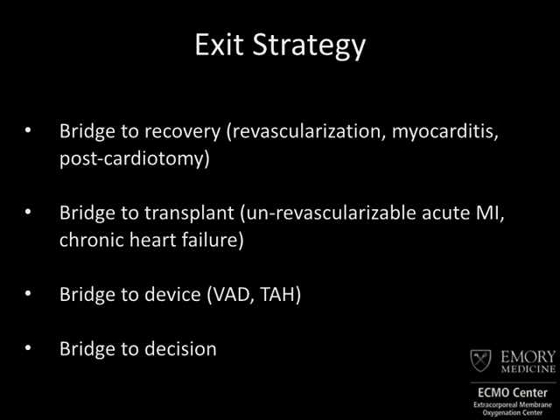There's the idea that this patient is going to need a transplant of some sort. So for example, they've had an MI that's not revascularizable and they're in chronic heart failure, so you're going to try to put them on ECMO and get them a transplant. And then there's this idea of bridge to device, which means that we're going to maybe not get them a transplant, but we'll get them a VAD or a total artificial heart or something along those lines that someday they'll hopefully get a transplant.